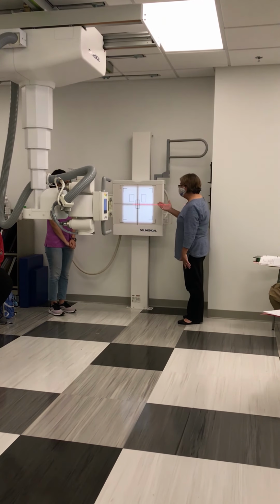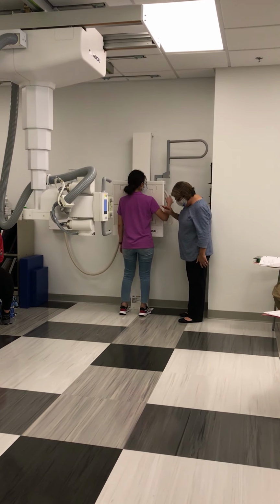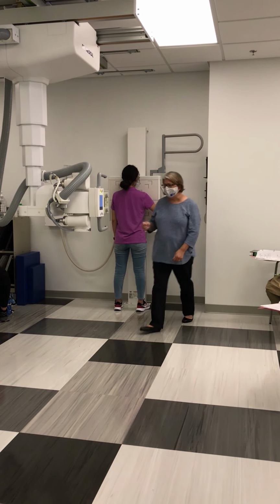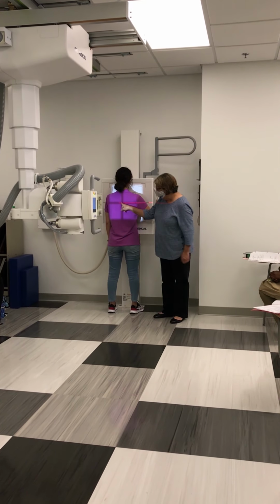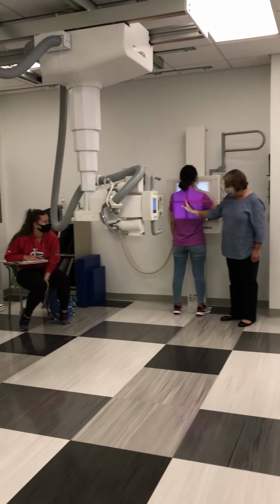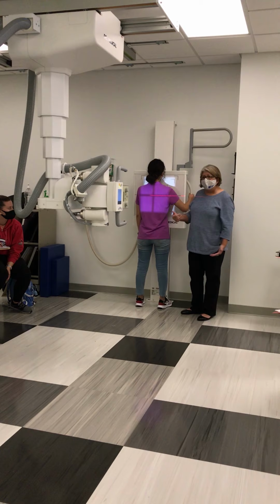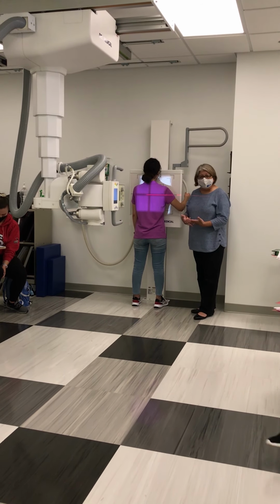collimation size. Now then, I'll have you stand with your chest against the board, forward, stand with your feet shoulder width apart. Grab a hold of that bar, that's good. Now I'm going to center. I know this is your central ray, right in the middle of those crosshairs. So I know that I need to center at the mid-sagittal plane, and I'm also centering at the level of T7. How do I find T7?